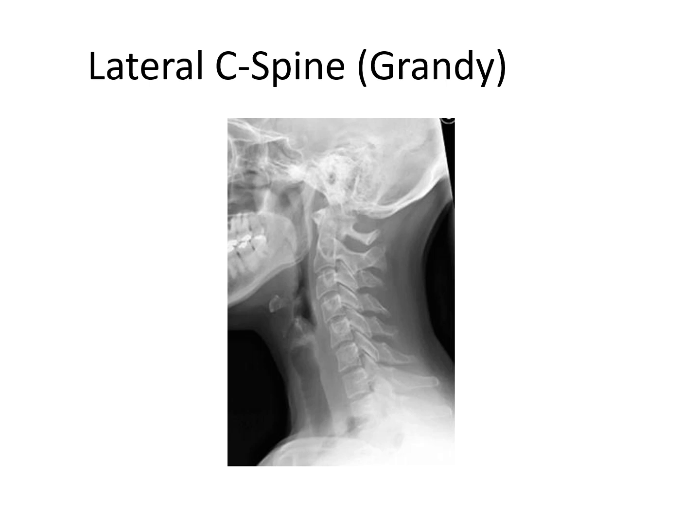And then immediately posterior to that, you see some black slanted lines with chunks of bone in between. Those are the pillars, the articular pillars, and the zygapophyseal joints. So it goes vertebral bodies, zygapophyseal joints and pillars, and then spinous processes from anterior to posterior. And that's what you can see on these lateral cervicals. It's basically three parts. And they should have a smooth alignment, a nice, smooth, natural lordotic curve.